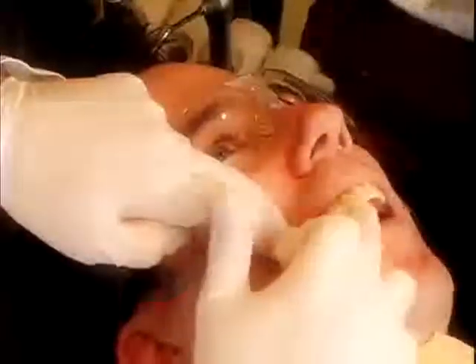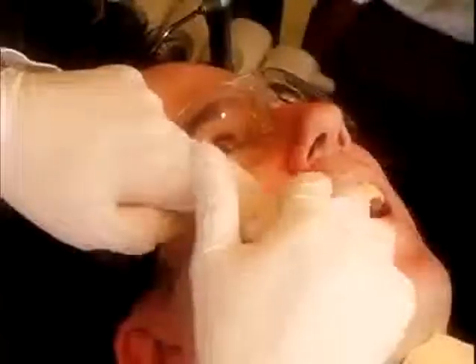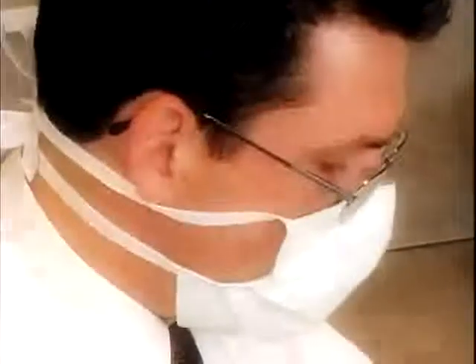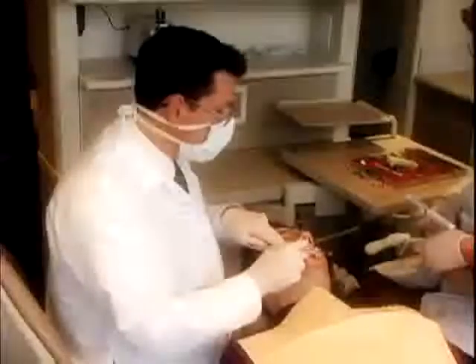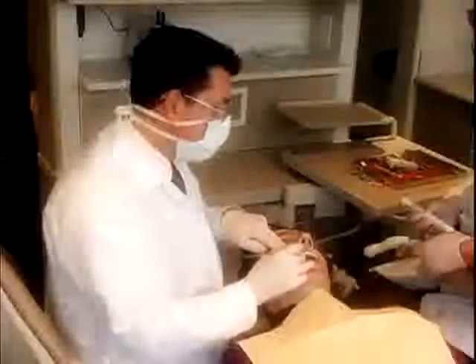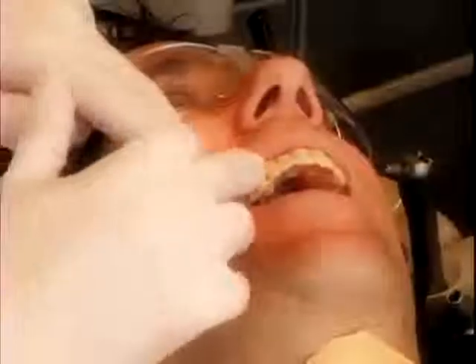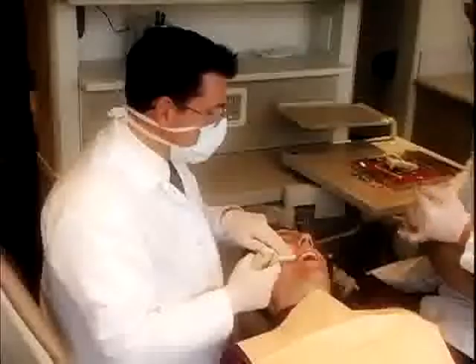The composite material I'm utilizing for this simulation is rather thick in character, whereas Lumineers can be as thin as contact lenses. Again, a simulation is a representation of possibilities and not particularly of the final coloration and form that we'll be targeting. We use devices such as shade guides and selectors to go through the specific coloration options. And we can discuss tooth forms, whether we appreciate a rounded or a flat, straight effect, as an example. In Randy's case, we're going to be carrying through the top 8 teeth in the front because it falls into a smile line.